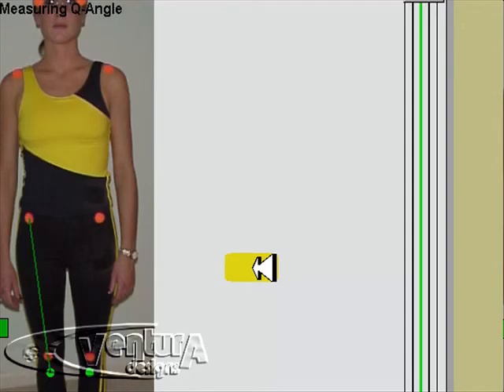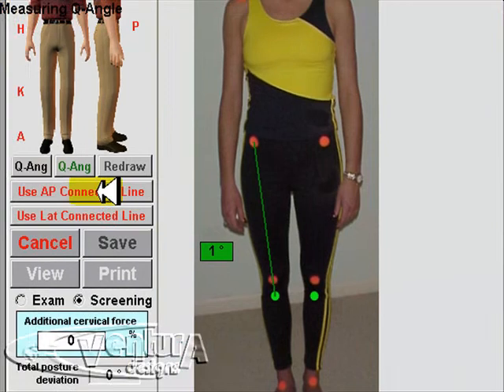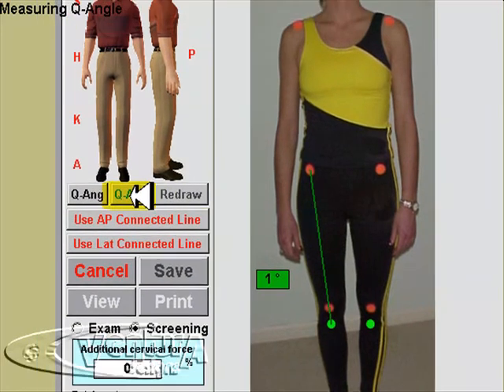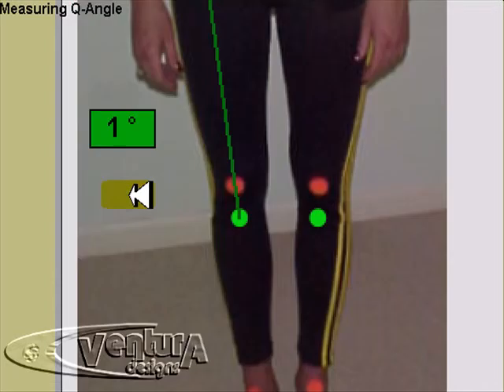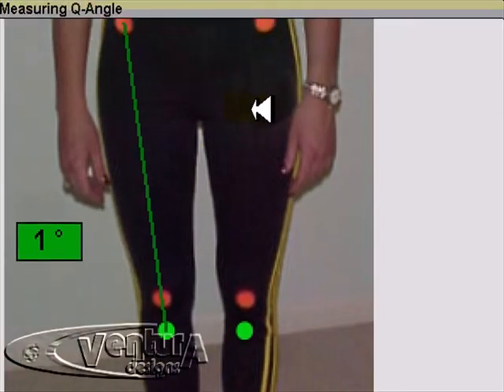This generates the Q-angle for the right side. To do the other side, we click on the Q-angle button underneath the mannequin's left foot, and again that zooms us in.